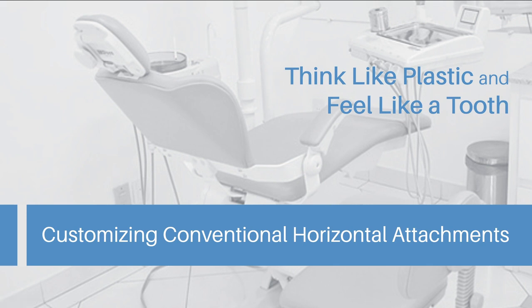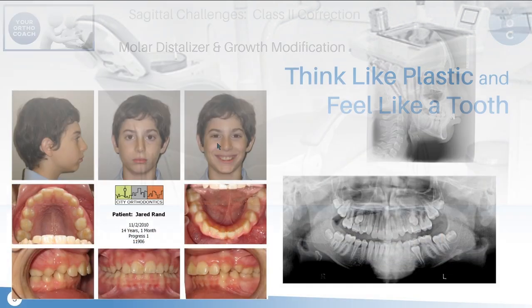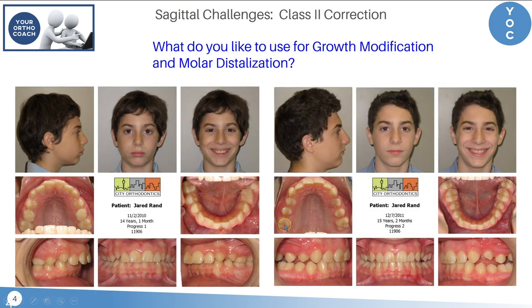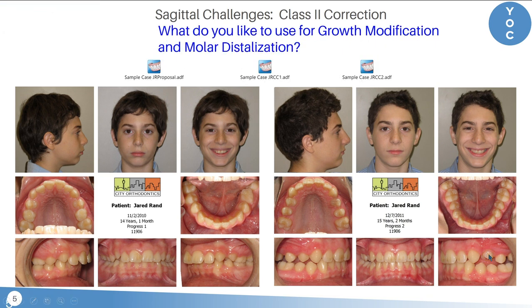There are a lot of things that we do in treatment of a particular situation, and I'm not going to go through the whole treatment of Jared right now — why I decided to use a phase one treatment to distalize his molars, correct the class two, improve the facial pattern of growth, and then walk into aligners to tidy up the details. But when I walk into the aligners and get my first ClinCheck, I'm going to show you how I customized horizontal attachments in his case to strengthen the forces needed to level the lower curve of Spee.